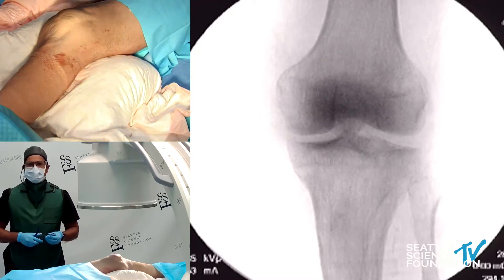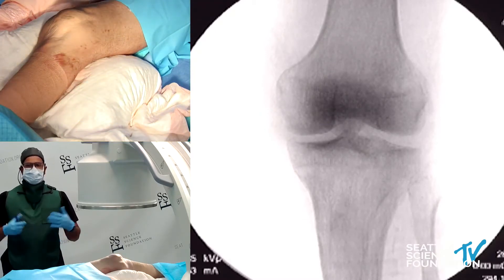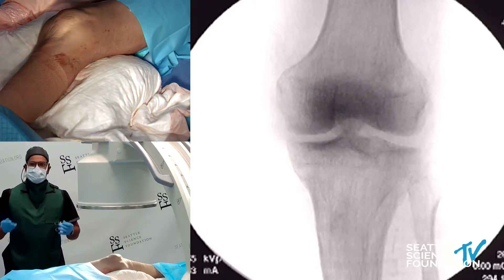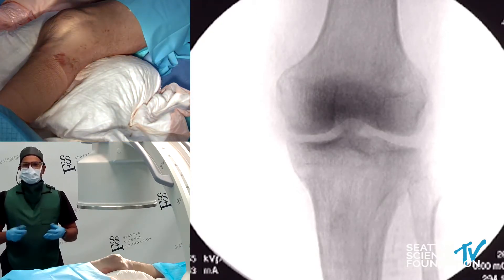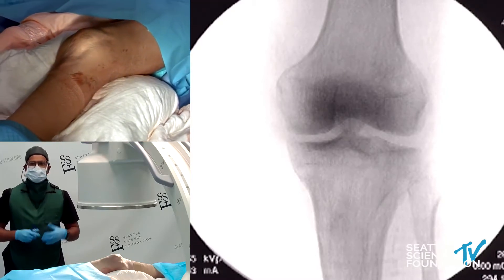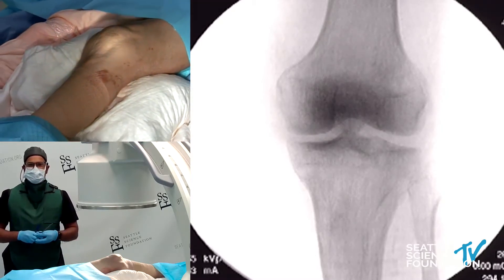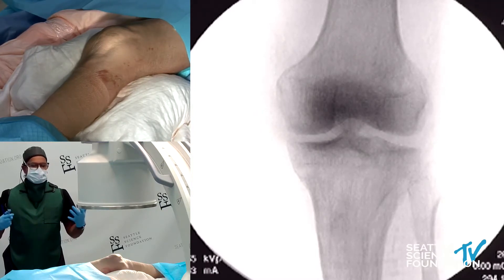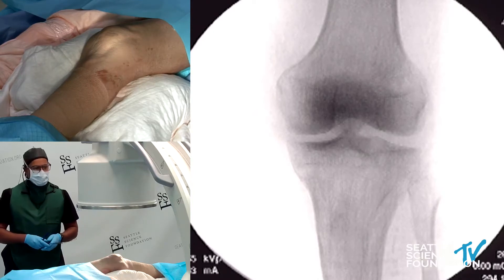Over the last couple of years, there's been a lot of great discussion about what are the best targets for the genicular nerves. What I'm going to show you here today is the fluoroscopic classic technique. I'll try to describe some of the discussion going on over the last year as far as what might be better genicular targets and help ensure that you have the safest way going forward.